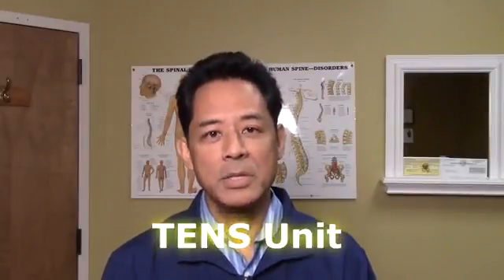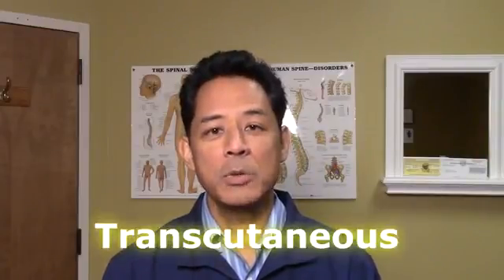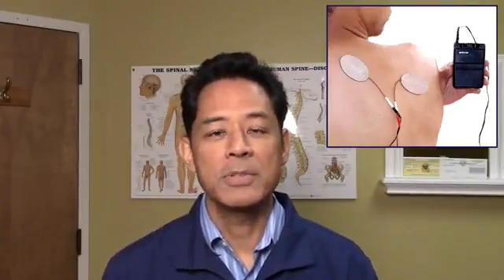If you're experiencing chronic or subacute pain, then there's a small device called the TENS unit which can help you get through that pain. TENS stands for transcutaneous electrical nerve stimulation. Transcutaneous means through the skin, and it does just that. It sends small electrical currents through your skin where it gets picked up by the nerves and somehow modulates the sensation of pain. Now, it doesn't cure pain, it just helps reduce the perception of pain.